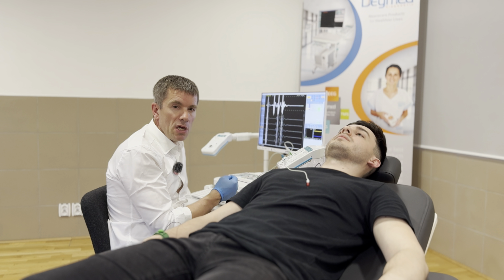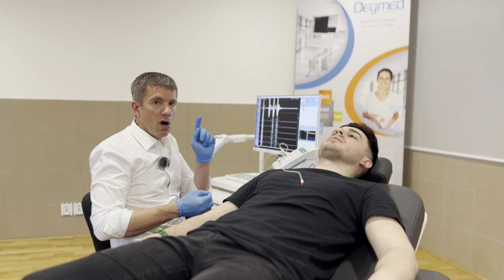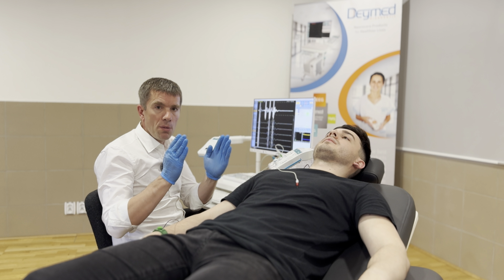But remember, in stimulated single-fiber EMG, a pair is constituted of a trigger, a stimulation trigger, and one muscle fiber.